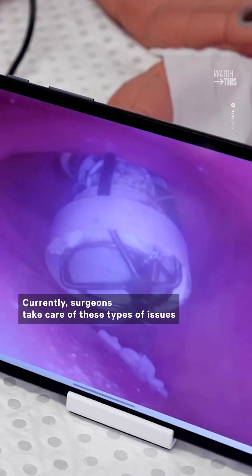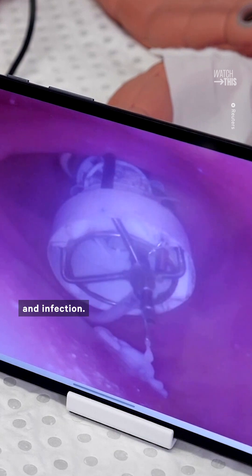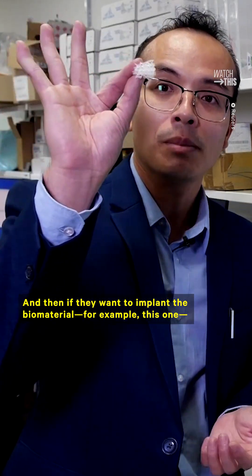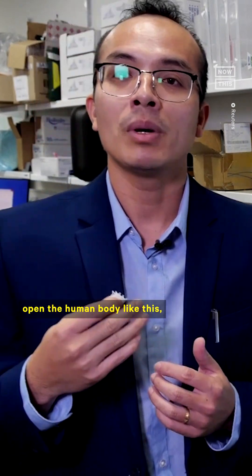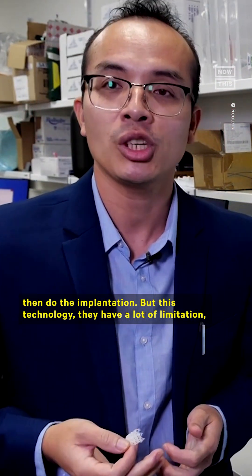Currently, surgeons take care of these types of issues with invasive surgery that puts a patient at risk of blood loss and infection. The current 3D bioprinting technology uses a large 3D printer machine like this, and the biomaterial it produces is very rigid and easy to break, meaning they have to open the human body to do the implantation.